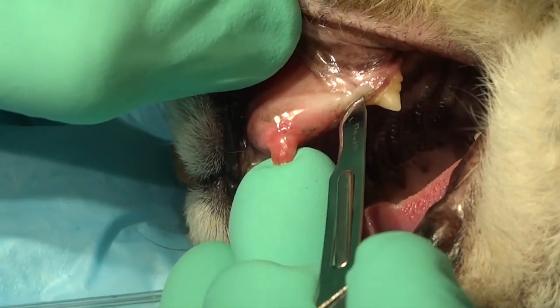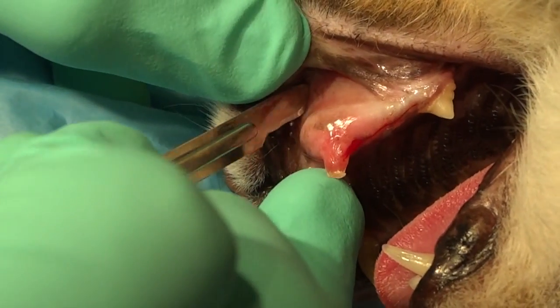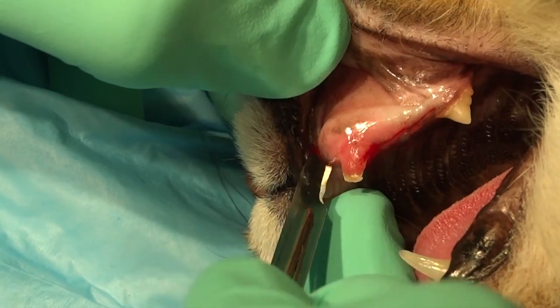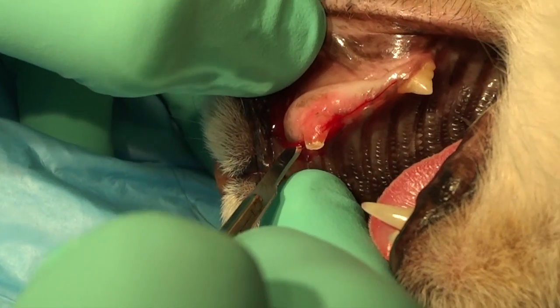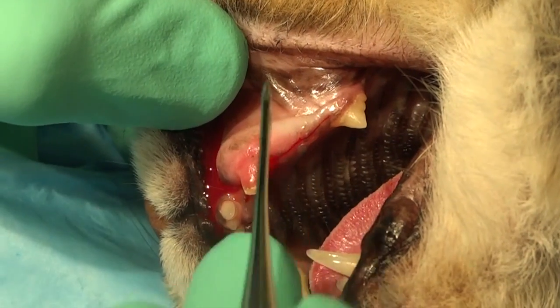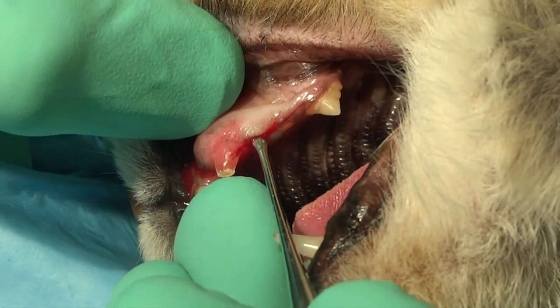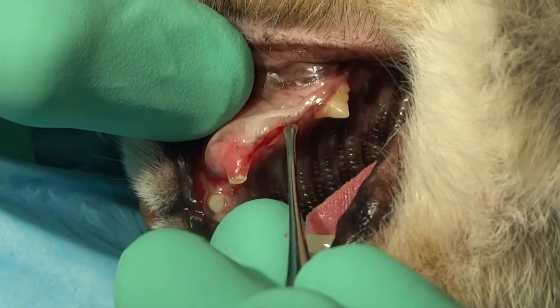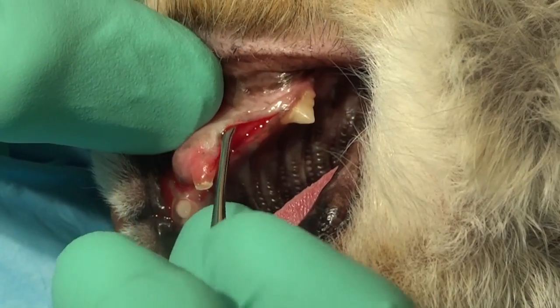Our incision is going to start here at the third premolar. We're going to extend that rostrally into the defect, and then we're going to come around with a vertical releasing incision to meet that, and then follow that with elevation until we get to the point where we've got exposure of that vestibular bone, which we're going to progress to remove with a burr — specifically a cross-cut tapered fissure burr.